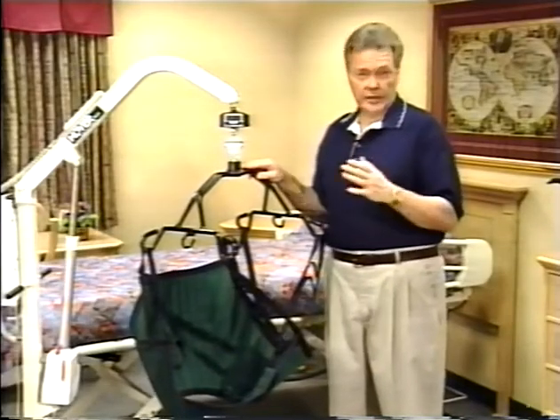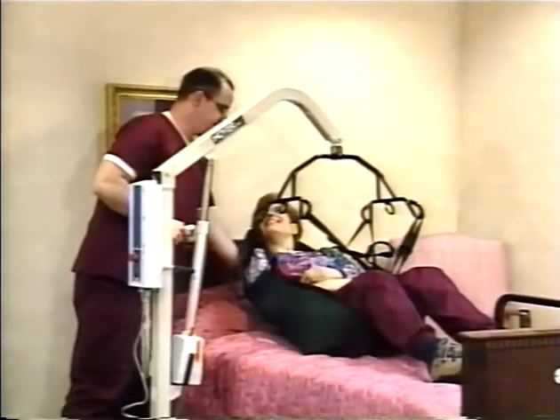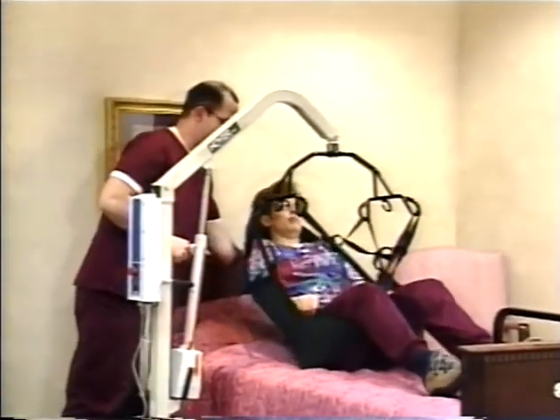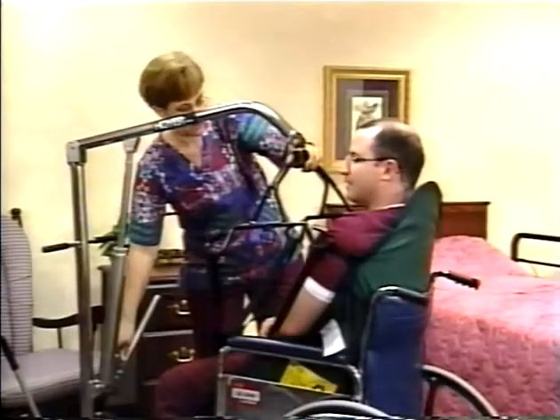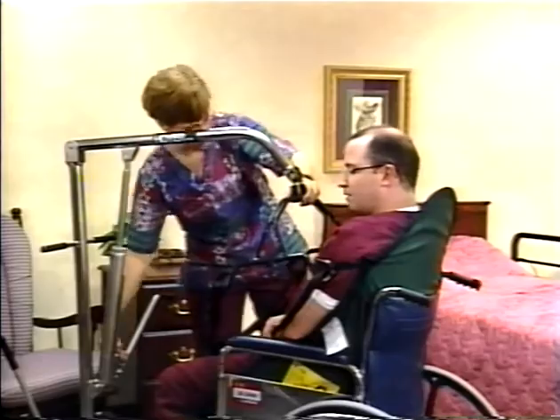Following the program, you'll be tested to make sure you understand each step of the procedure. You'll also be given the opportunity to practice lifting each other. As a caregiver, it is equally important that you understand how a resident feels during a lift.